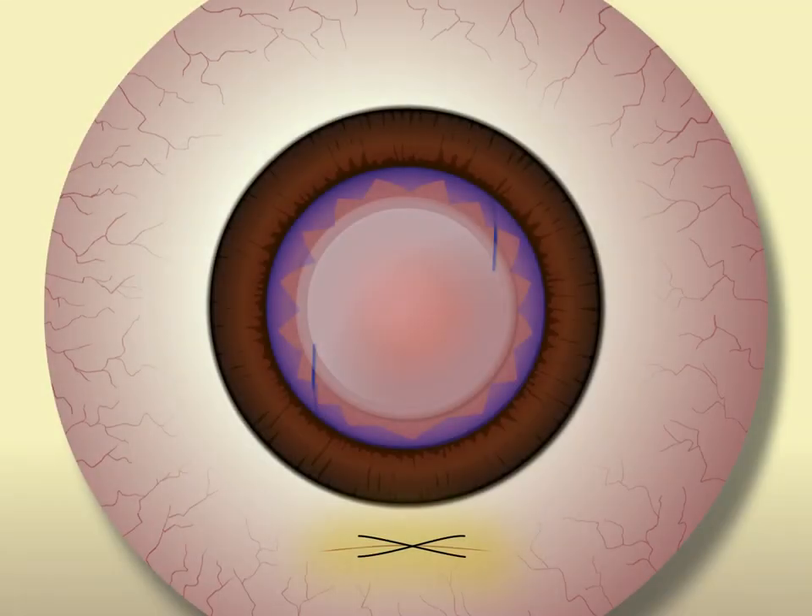The suture material is then covered with conjunctiva. A running nylon X-suture without external knots that is completely covered by conjunctiva generally will not erode, will not need to be removed, and tends to remain comfortable for patients indefinitely.